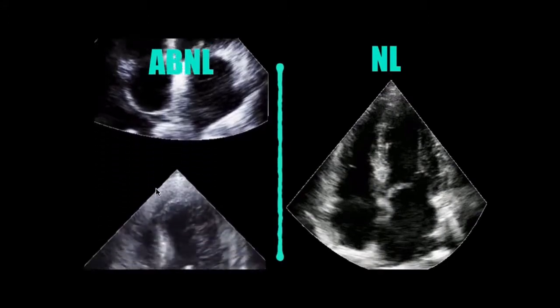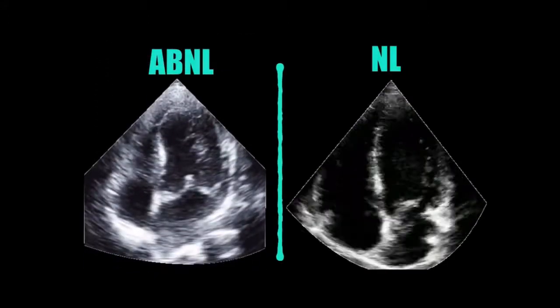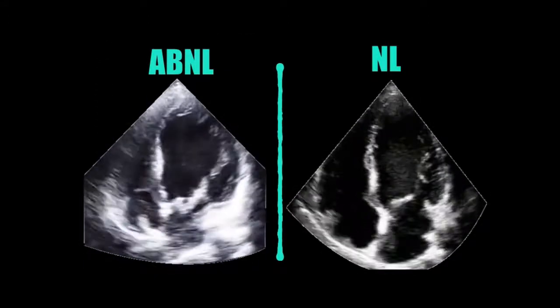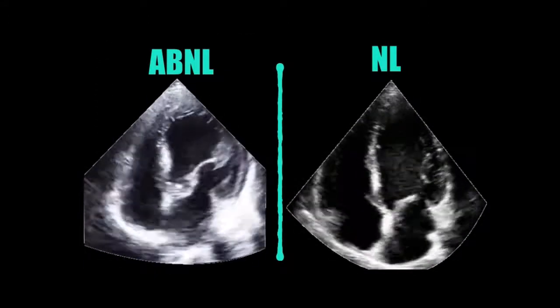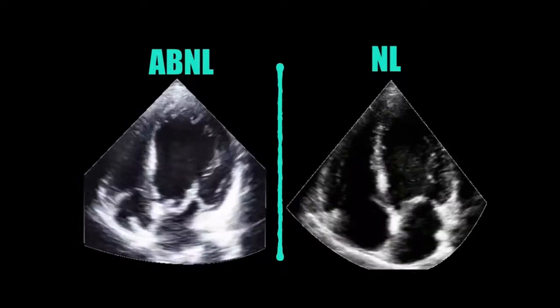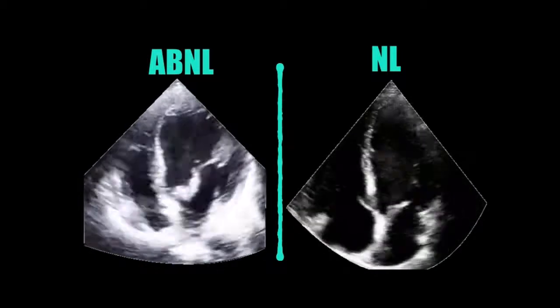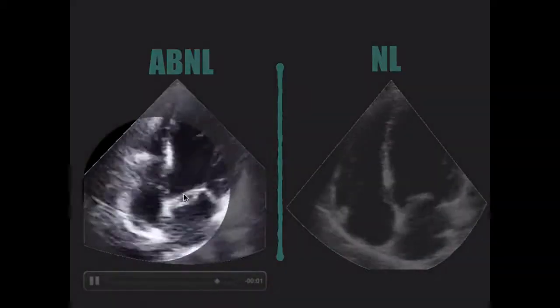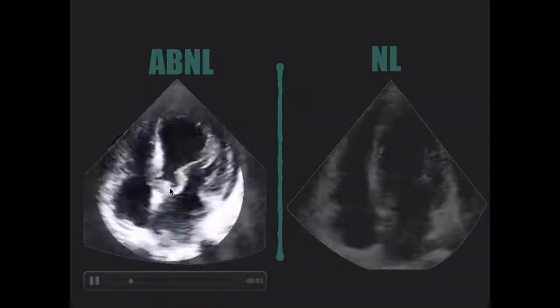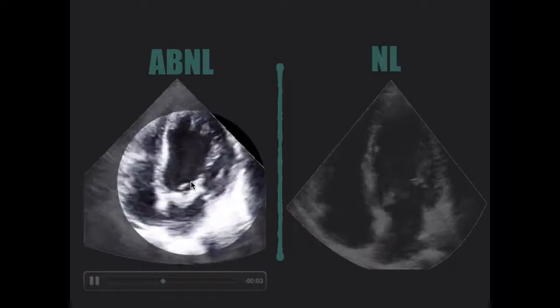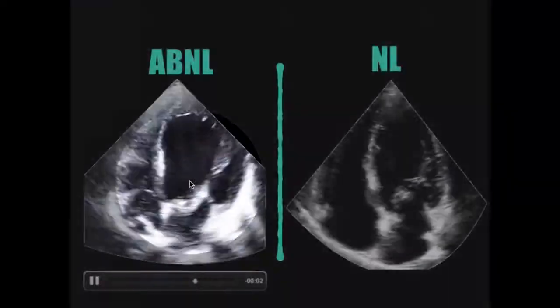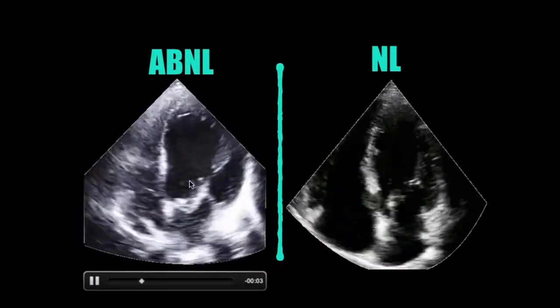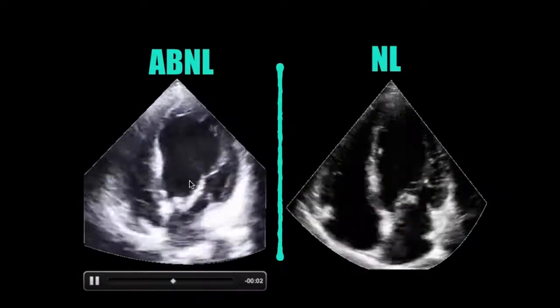Keeping on that same view, this is what mitral valve endocarditis looks like. It's a little trickier to see, but you can see there's a little kind of flappy thing right about there — that is mitral endocarditis. And on the right side of the screen, you have what normal looks like.